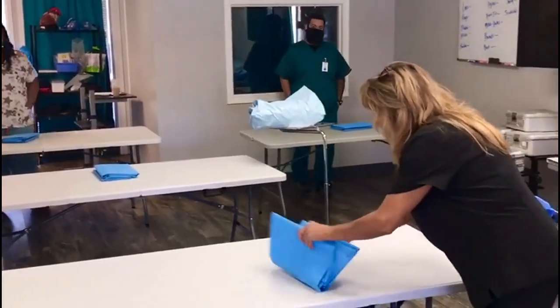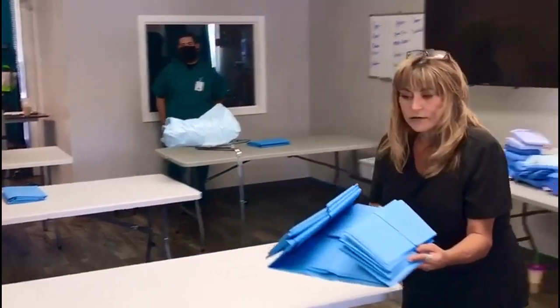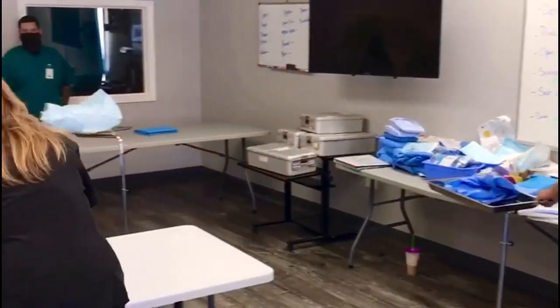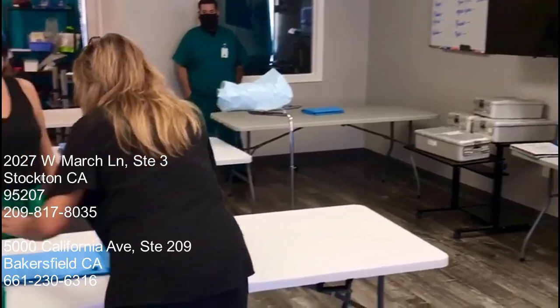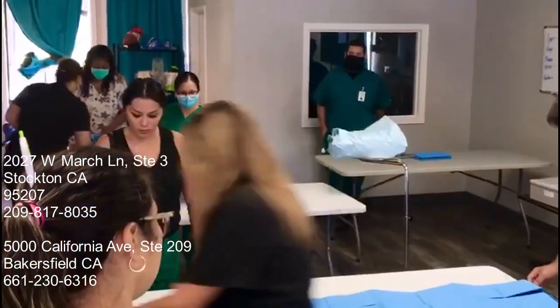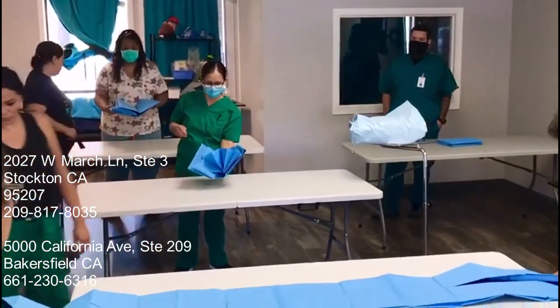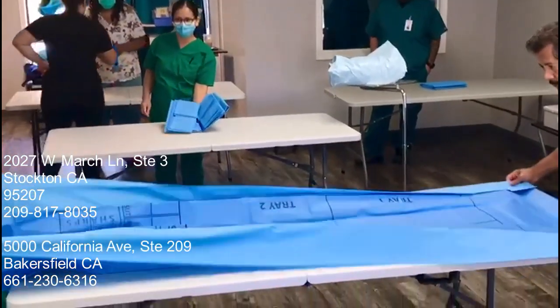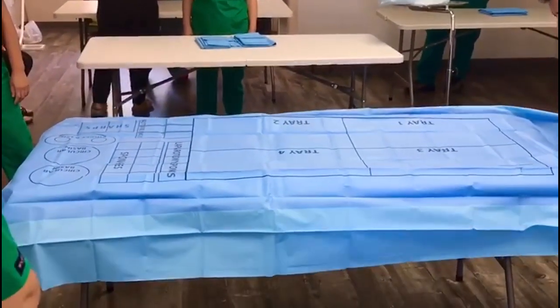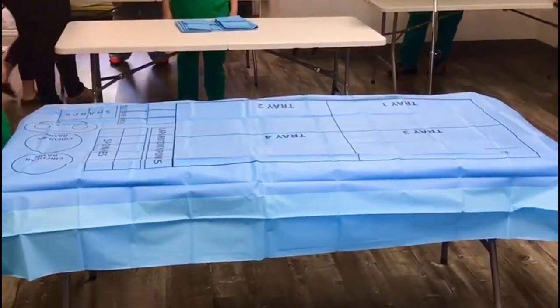We're going to grab it and we're going to look for the middle bend. See that middle bend, everybody? I'm going to take one end of it, pitch it on one end of my table. I'm going to grab the other end — grab it that way. Now, sterilely, coming to the bottom, I'm just going to grab the corners with John, and we're going to bring it down just like that. That is how we drape a back table sterilely.